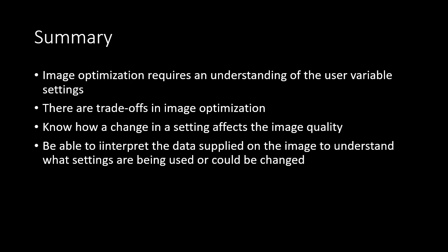Say you are reading remotely, ultrasound images are being generated in another hospital. You can quickly look at all of the information and notation supplied on the image, look at the quality of the image, and you can start to understand, why is this image suboptimal? Does the ultrasonographer know what they're doing, or is it a patient who has difficult body habitus or is having difficulty holding their breath or holding still?